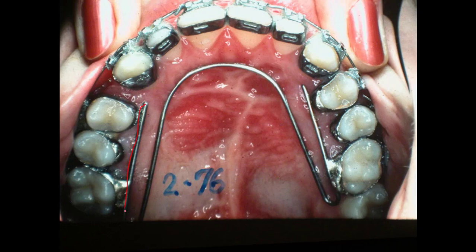This is just to ensure that the thing stayed out. I don't think I really had to have that — I could have probably done it with the arch wires. It's one that's hard to keep apart. But you can see where this was sewn together, and this is the place where there is no bone — it's just tissue, but it's a thick tissue in there on both sides.